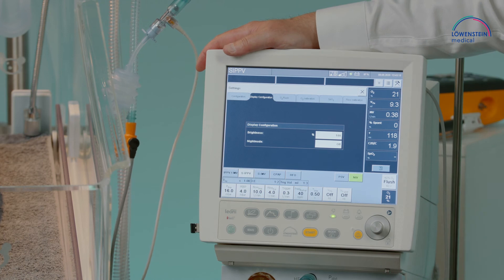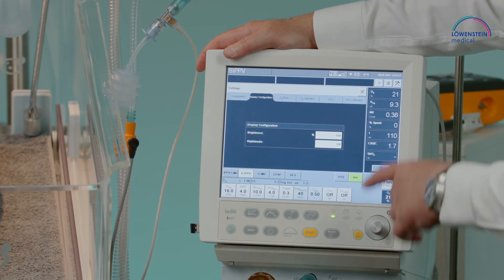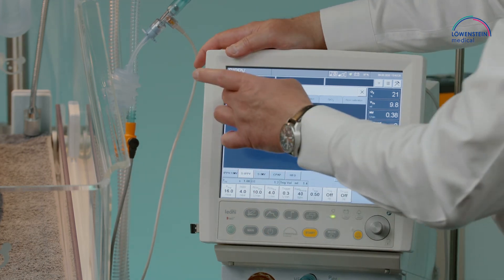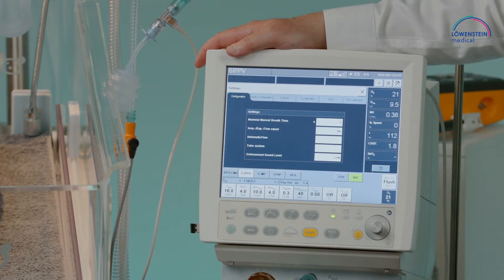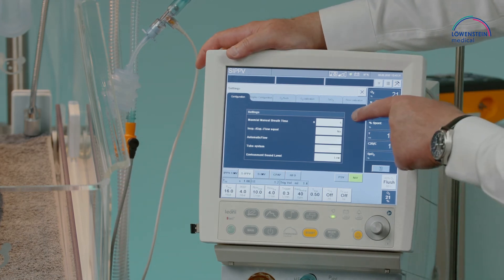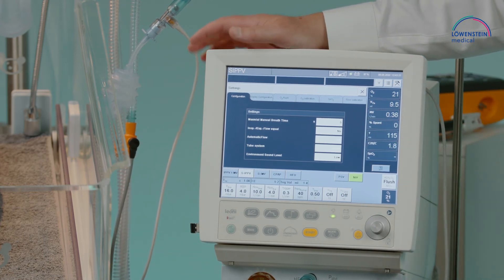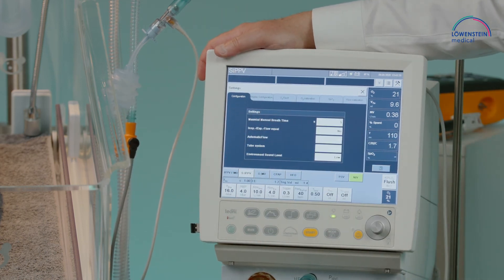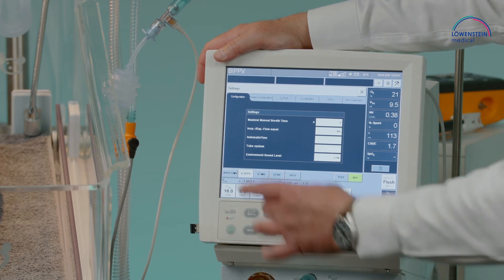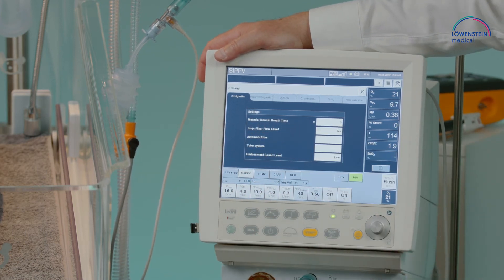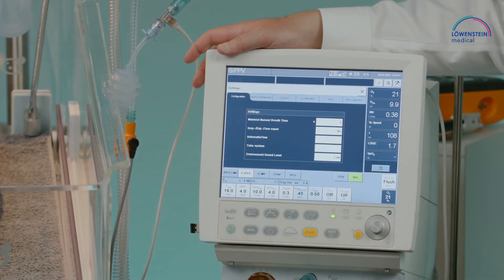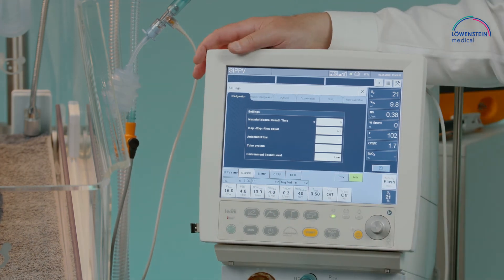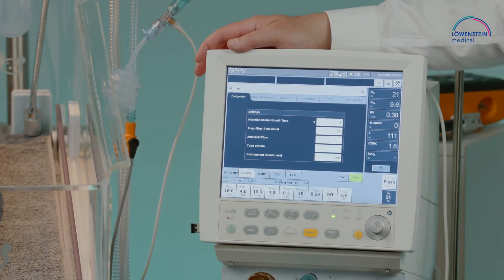The display configuration includes brightness adjustment and activation of night mode. In the configuration screen you can adjust the maximum manual breath time, set the flow profile of the ventilator, configure automatic flow for non-invasive ventilation, select the tube system, and adjust the environment sound level.